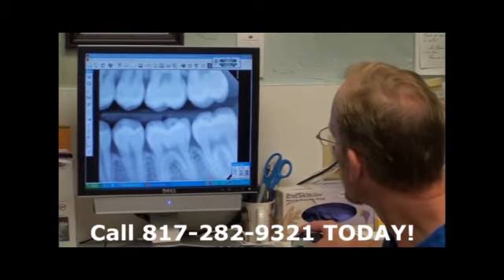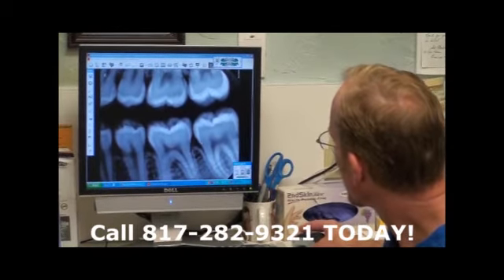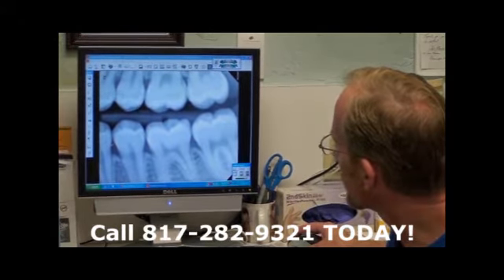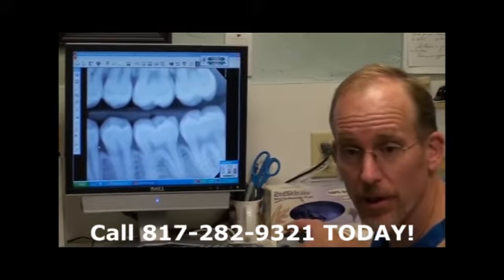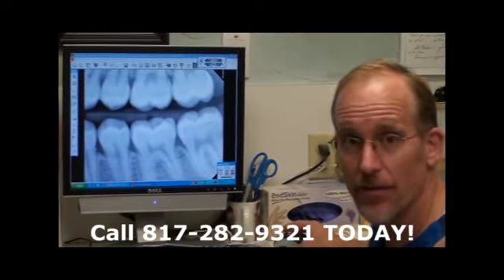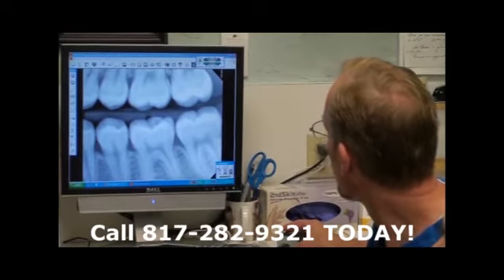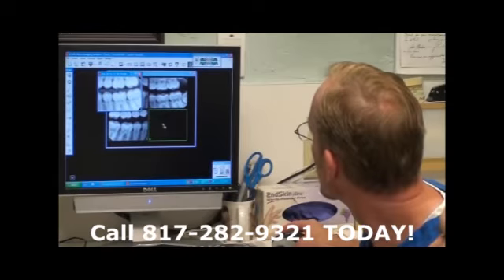In this particular x-ray we can go much darker, but sometimes that's not better. When it's lighter, sometimes I can see areas on the teeth where there's tartar buildup, or where you can tell that they haven't flossed and have buildup. And then we look for small areas where they potentially have cavities.